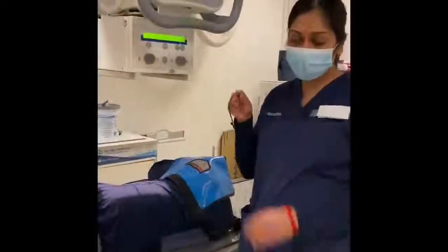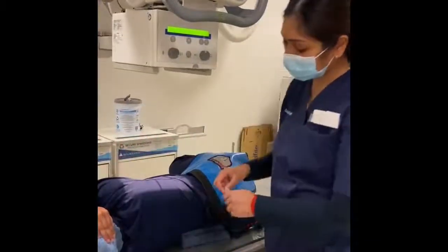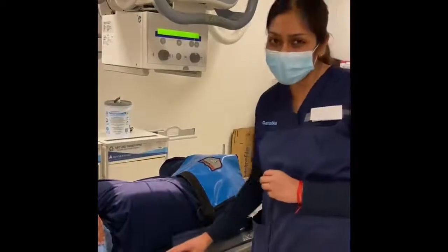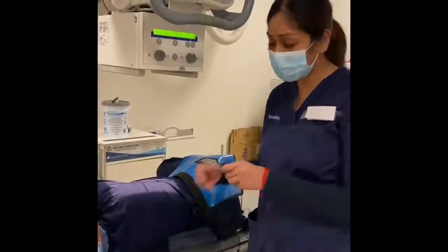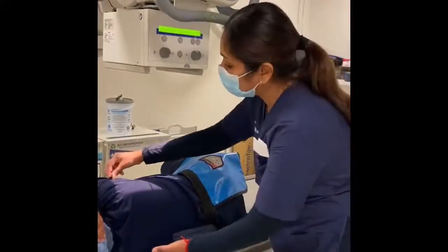So the other thing that we just need to mention is to place our markers. With our patient, the left side is closest to the image receptor, so we are demonstrating the left side of the T-spine. So we can place your marker readable, just place it on the top, and that should be fine.